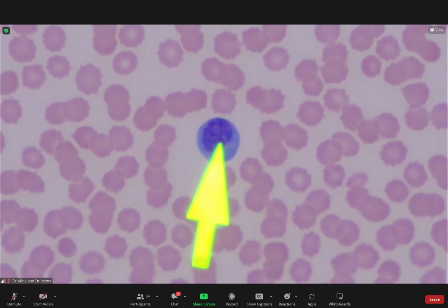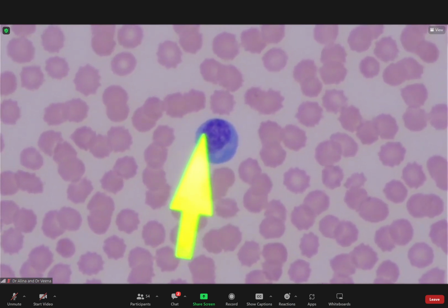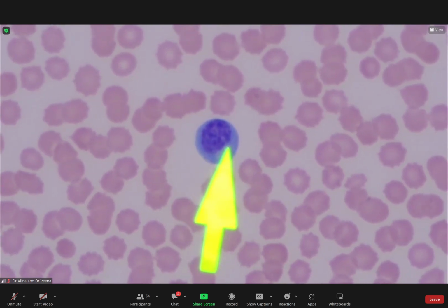Your M6 will come with blebs. Your M6 will come with these blastic erythroid cells, not homogeneous. You'll have a variety of blast-looking cells, pro-erythroids, right? Plus blebbings in your blast. They didn't have blebbings. You look at the nucleus, you tahu that this is not a blast. It's too clumped. Do you see? It's too clumped.